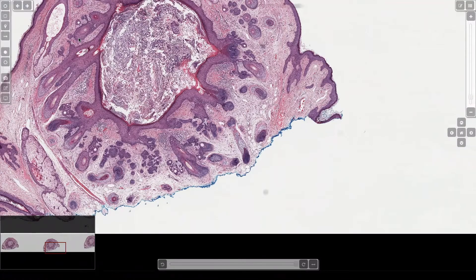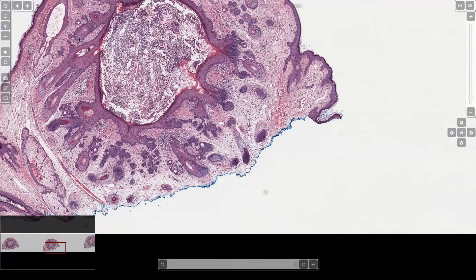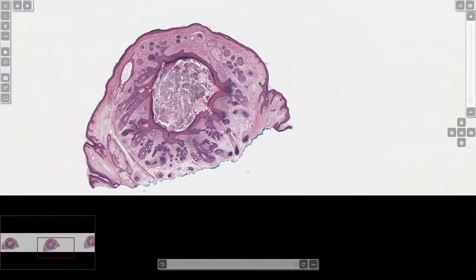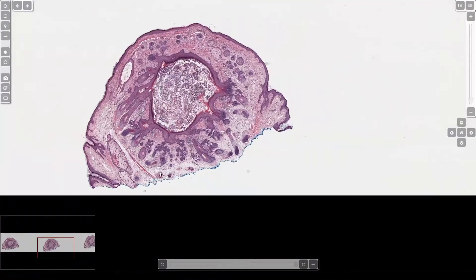Many follicular tumors have that fibrous kind of cellular stroma, as opposed to basal cells, which get that more myxoid mucinous loose stroma, right? So I think that's a nice clue for follicular neoplasia. When you see this kind of pink stroma that's separating the tumor from, see, here's the rest of the dermis out here and over here. And if you go way back, you can kind of almost imagine this is like the border of the lesion out here is like where the stroma goes. It's like a circle around the whole thing. And I feel like it's a little harder to appreciate unless you've seen it up close. But I think that's actually a really useful clue that helps me with follicular neoplasms.